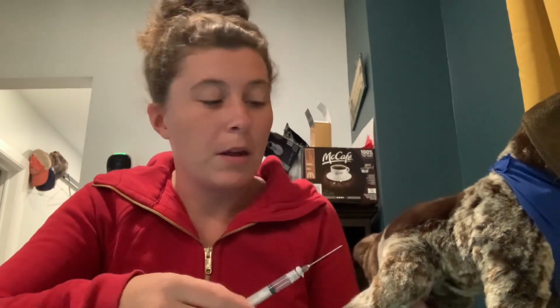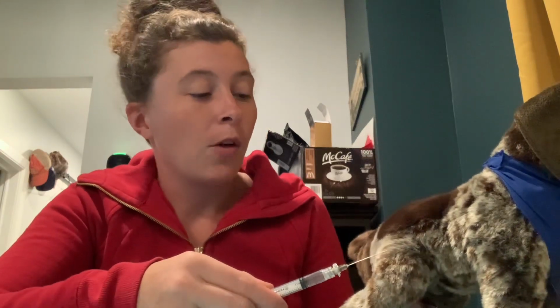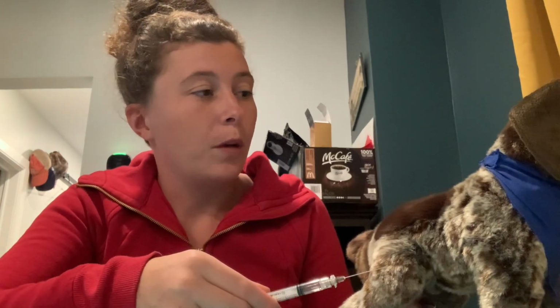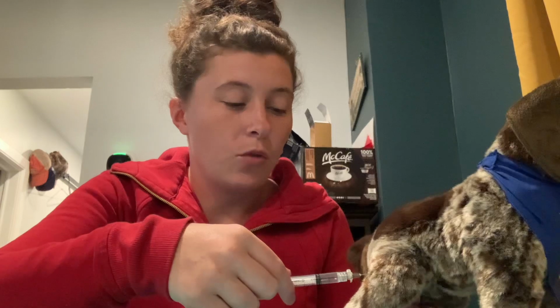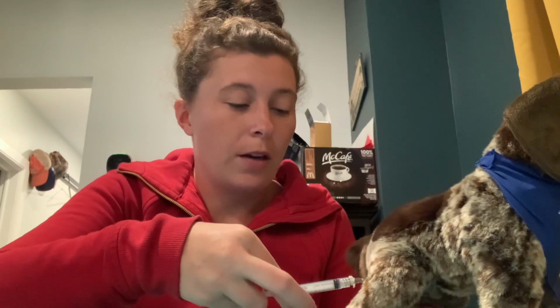We're all set. Okay, I've got my vaccine or my medication all drawn up here in my syringe. So now I've got my bevel up again. I want to go in a medial lateral direction. I want to make sure that I am not going in a caudal direction, because right behind where I'm going here, that's where the sciatic nerve is going to be. And if I could go a little bit cranial if I wanted to. Okay. I want to make sure that I draw back, see if there's a flash. No flash. That's great. So now I can advance.